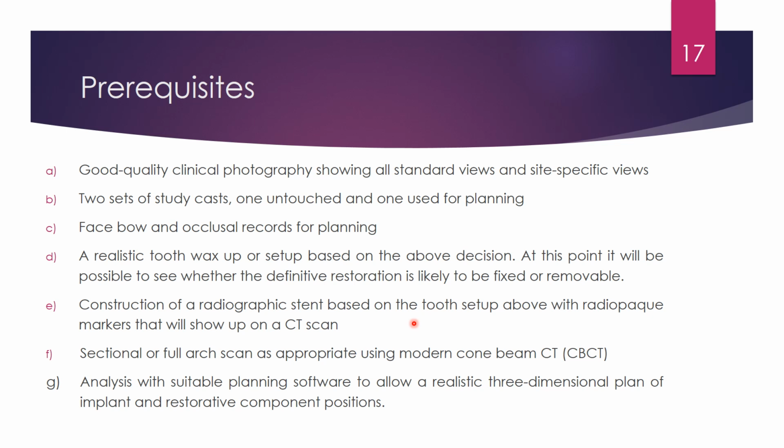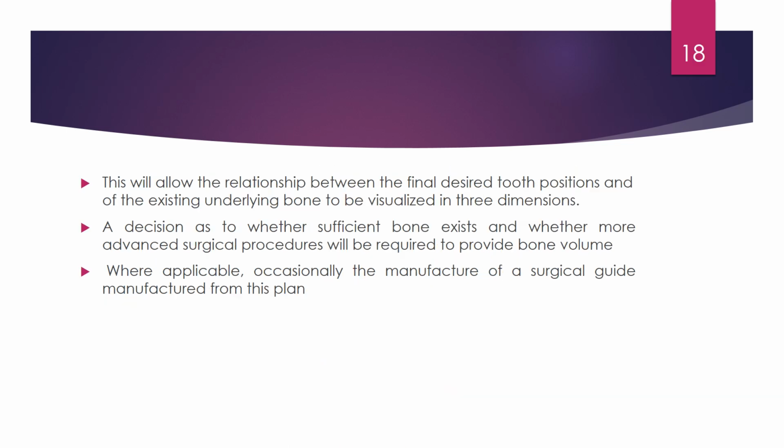Okay, so why do we use radio opaque markers? It'll show up in the CT scan, any sectional or full scan, which is done by CBCT. Coming to the last prerequisite, that is analysis with suitable planning software to allow realistic 3D plan for implant and restorative component positions. Okay, so these are a set of prerequisites.